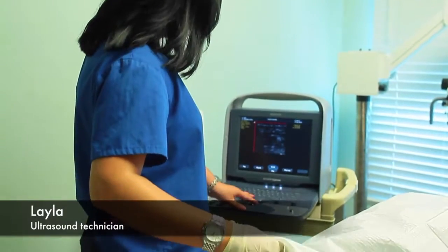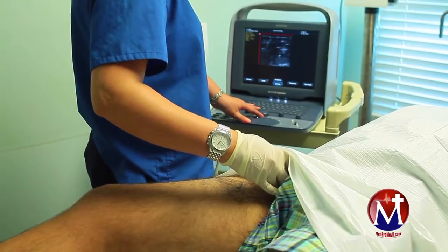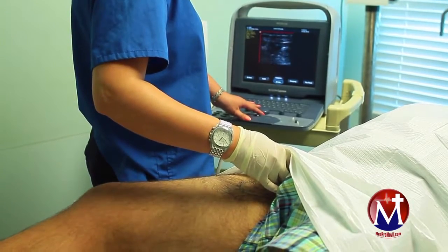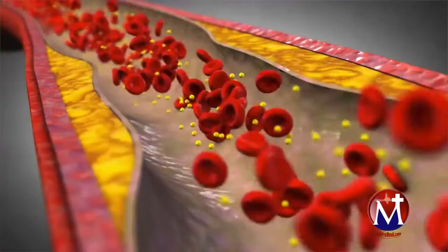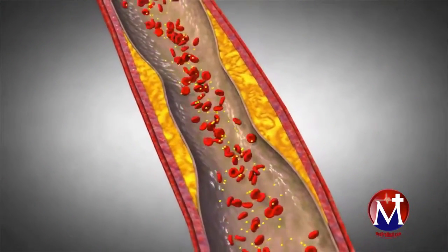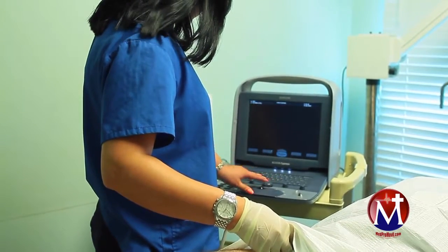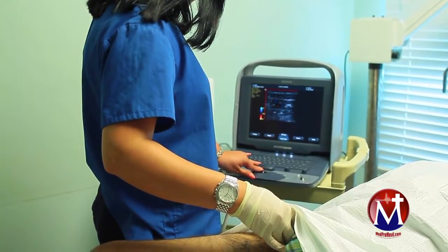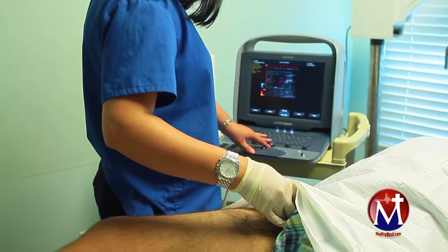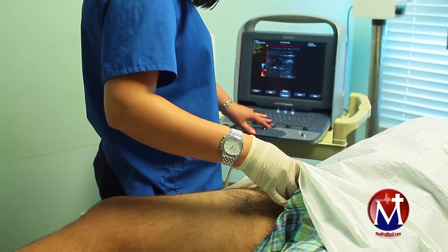Layla is performing a venous Doppler ultrasound of this male patient's right leg. Venous duplex imaging is used to evaluate blood clots, venous insufficiency, incompetence, or tumor masses that may be obstructing veins. Acute and chronic thrombosis can be differentiated. In addition, this procedure may be used to detect superficial phlebitis and obstruction.